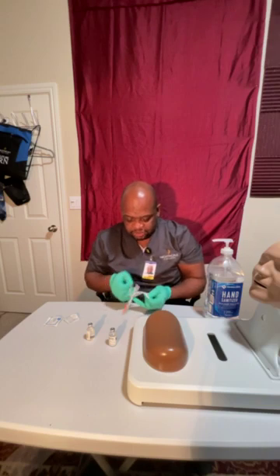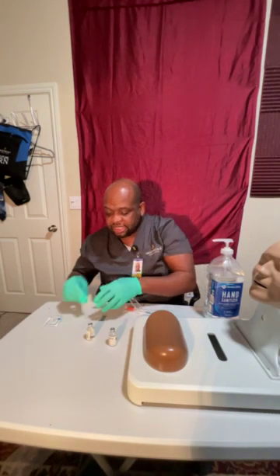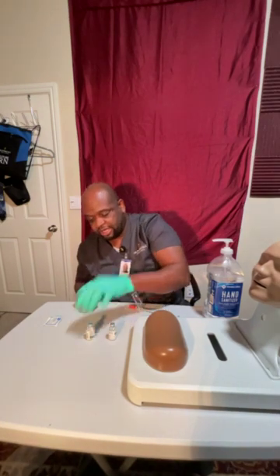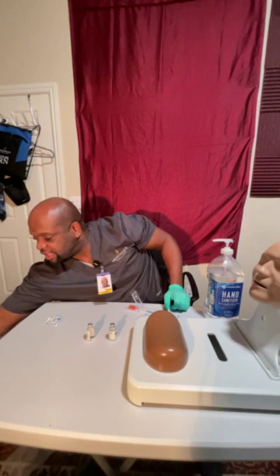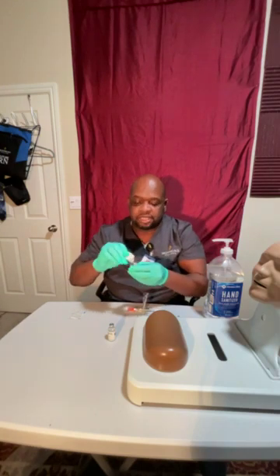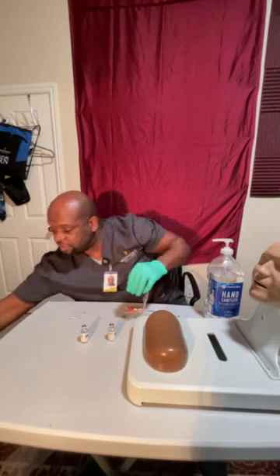And first things first, let me wipe off the top. Now that I'm done rolling, I want to wipe off the top of the insulin bottles with this alcohol wipe. I've got 2 alcohol wipes I'm going to use, one for each bottle. So let's do the NPH. Let's get rid of that one, throw that in the trash. And then I have another alcohol wipe. I'm going to wipe off the top of the regular, right? So we're going to let that air dry for both of those.